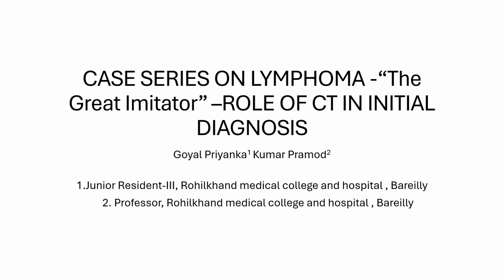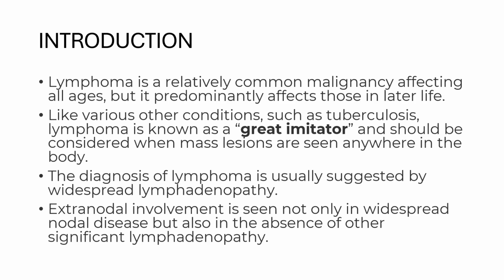Hello everyone, I'm going to present a case series on lymphoma, which is known as the Great Imitator, and the role of CT in initial diagnosis. Introduction. Lymphoma is a relatively common malignancy affecting all ages, but it predominantly affects those in later life. Like various other conditions such as tuberculosis, lymphoma is known as the Great Imitator and should be considered when mass lesions are seen anywhere in the body.